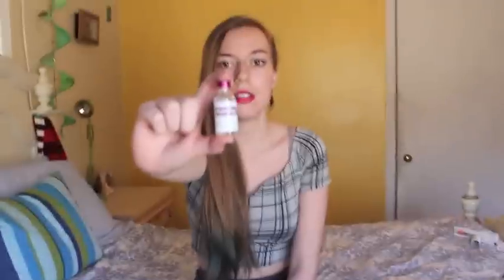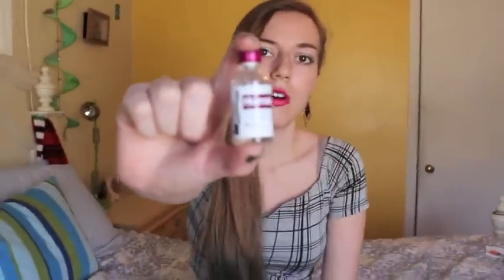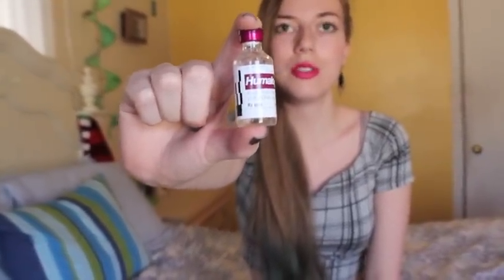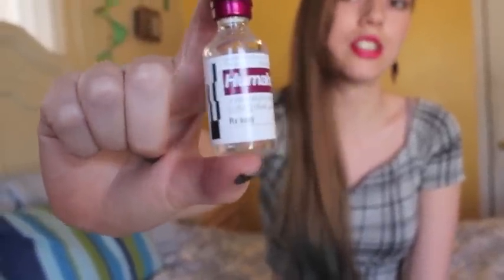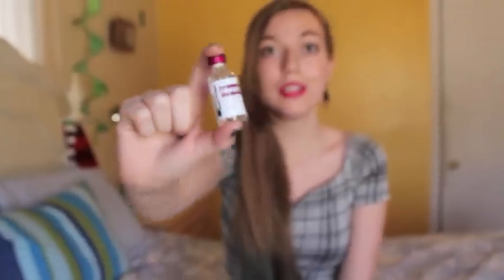So in order to change an Omnipod, you're going to need 4 things. The first being your insulin. This one is called Humalog, and it's kind of funny because this is the first time I've ever used Humalog. I used to use Novolog, but since our insurance plan changed, they switched me to Humalog. And apparently they're interchangeable, so hopefully nothing bad is going to happen to me.